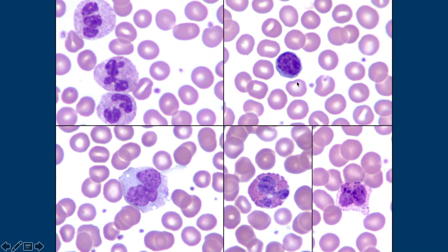This is a small, mature lymphocyte. The nucleus is about the size of a red blood cell, and it has a thin rim of blue cytoplasm. In adults it is the second most common leukocyte, but in newborns it is the most common leukocyte — that switches somewhere during the aging process.